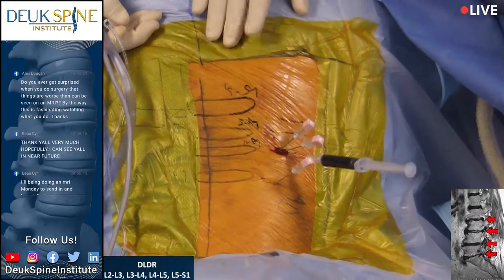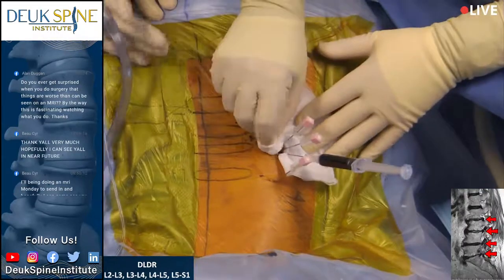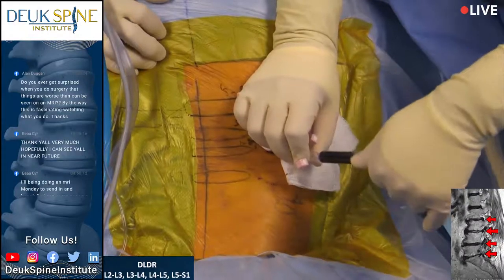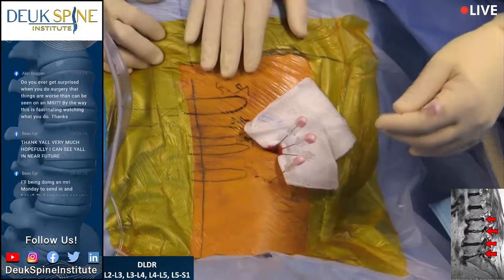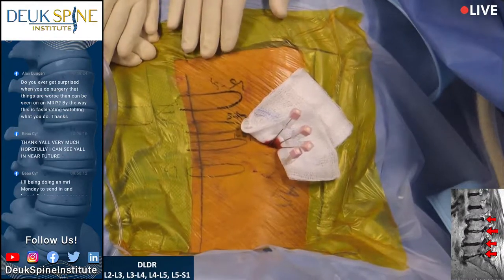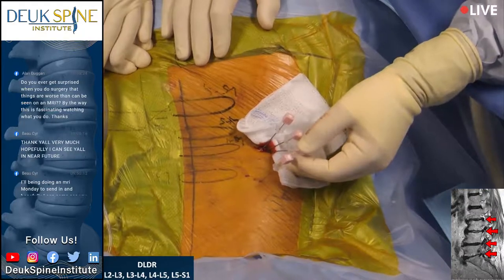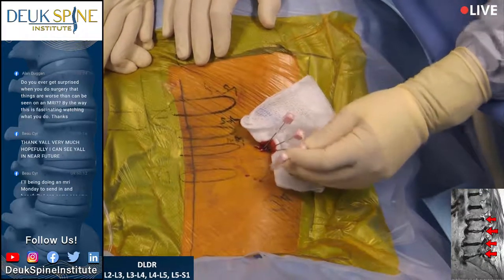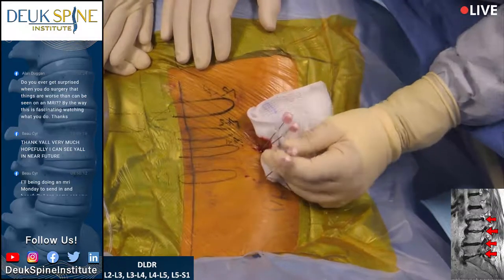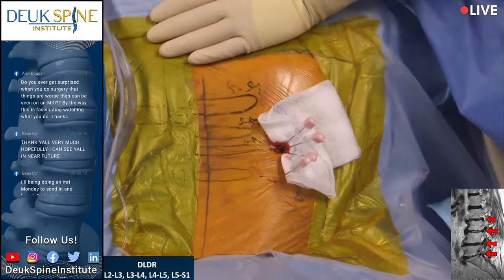Are you comfortable right now, Carmen? Yeah. He said no. Lay still. He said okay. All right, so actually 5-1, we need to advance a little further. Where is your pain right now, Carmen? Back or leg? Back. Yeah, just lay still. Stop trying to get up. Let's get an AP. You're doing great. Lay still. We're going to put you to sleep in a minute.